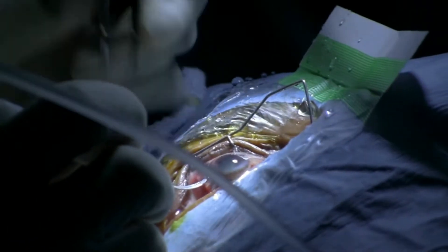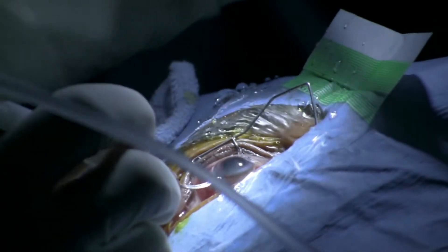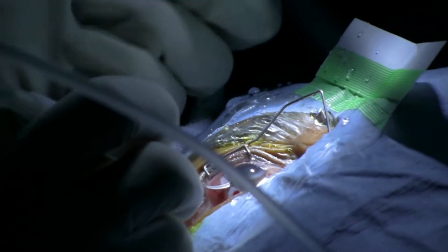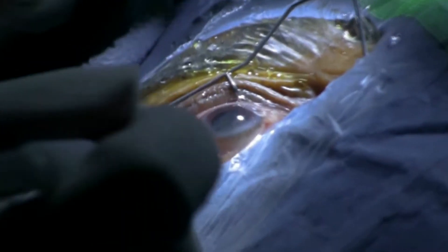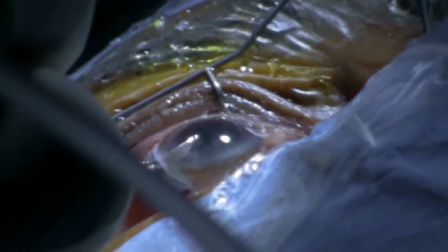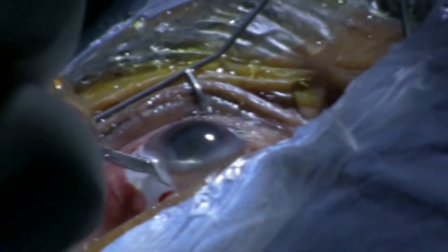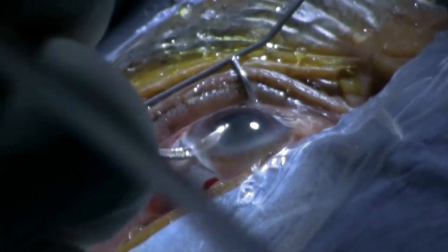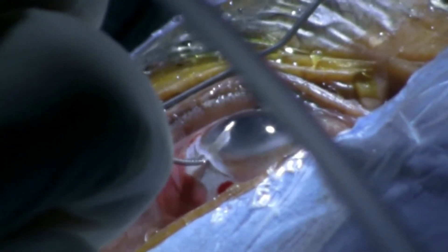Exposure of the operating field during cataract surgery is important. Adequate exposure facilitates easy instrumentation inside the narrow cavity of the anterior chamber. Poor exposure compromises the space available for instrumentation and makes the surgical steps difficult.